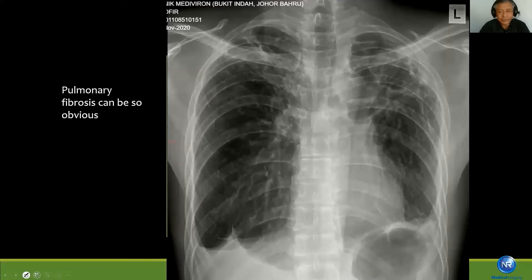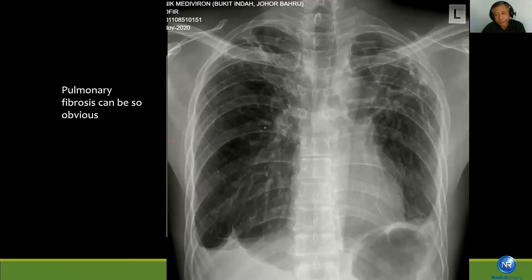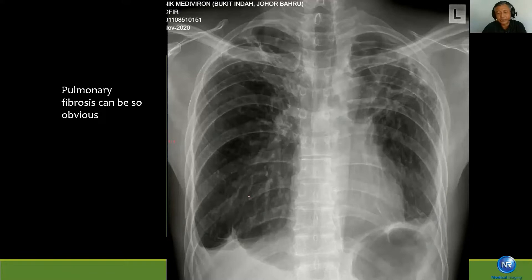Apical fibrosis can be obvious. In this case, you can see linear shadows in the right upper zone and linear shadows in the left upper zone. Even both hila are actually elevated — because when there is fibrosis, it pulls up the normal tissue. And look at the diaphragm: there is blunting of the right CP angle and blunting on the diaphragm. So this is a very gross example of apical fibrosis.